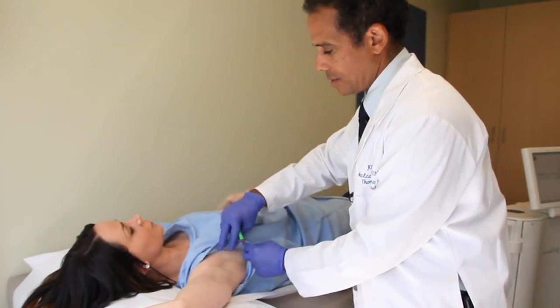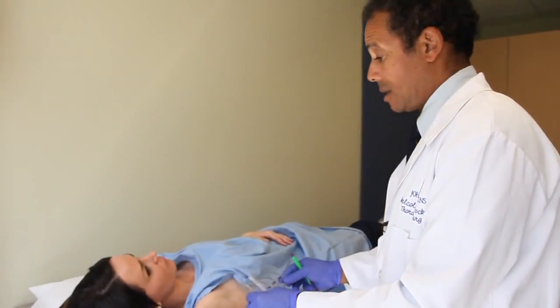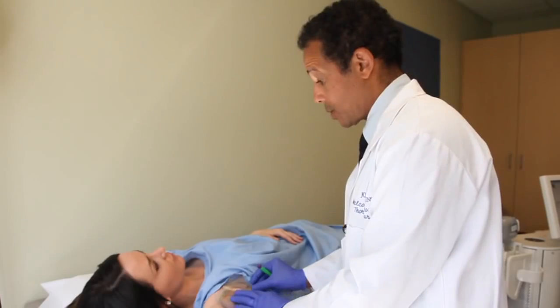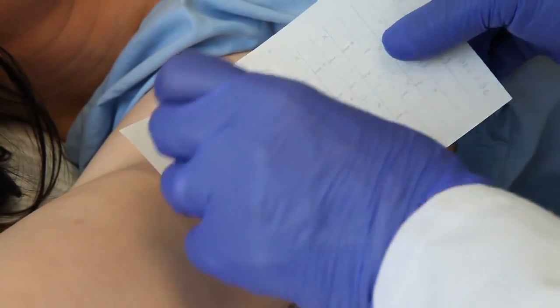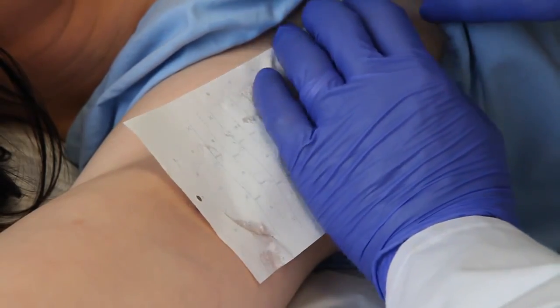The first thing we're going to do is measure your underarms — measure where your sweat glands are — and put two little dots. We're going to put a template, almost like a little water tattoo that kids have.